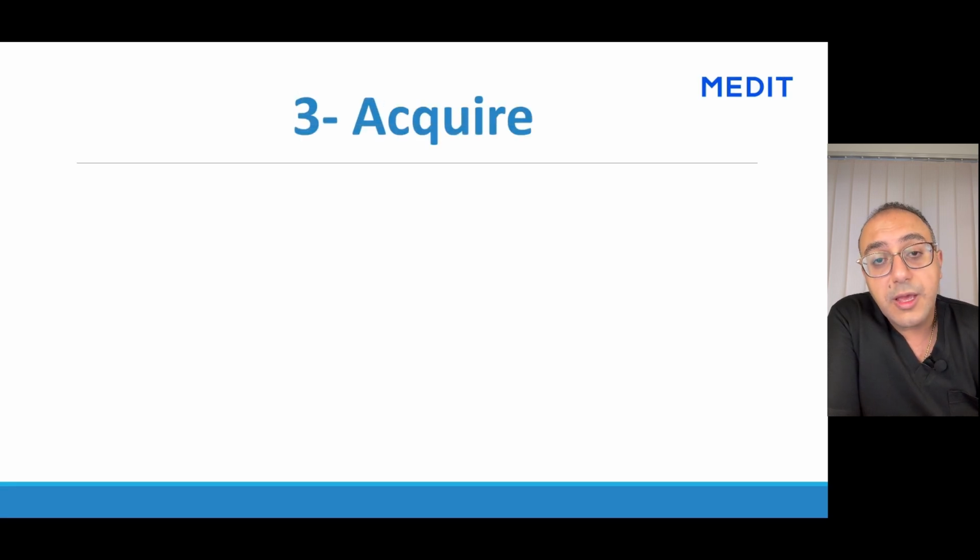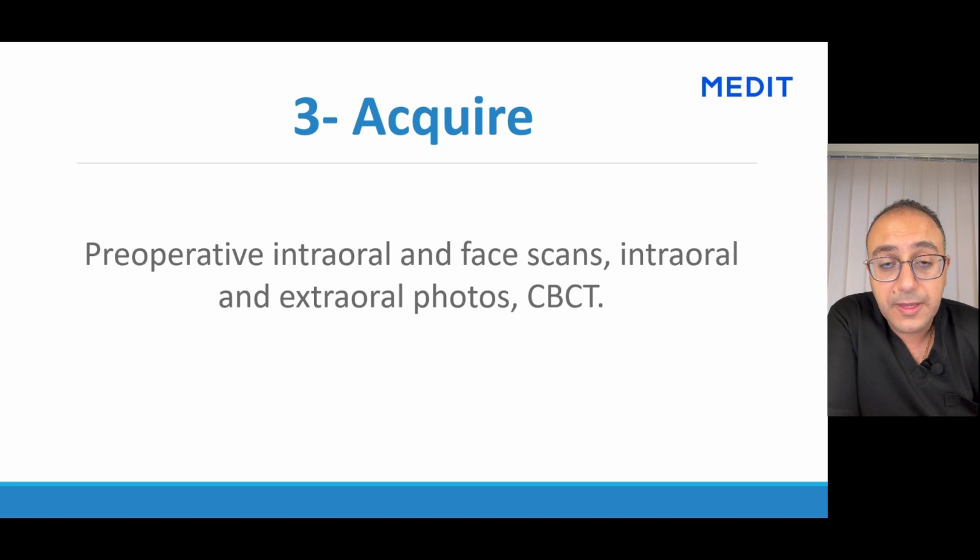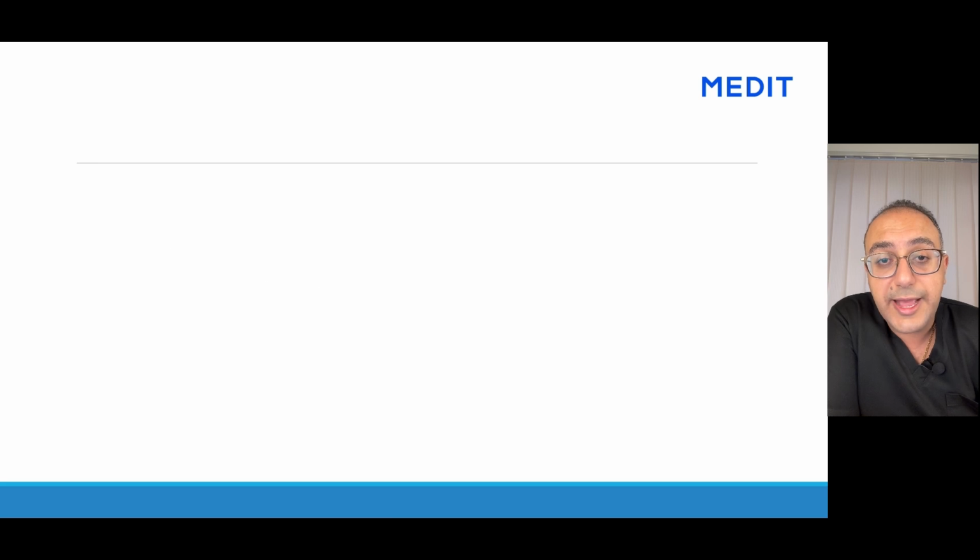Then the third step is acquire. Now it's time to bring your Medit scanner and start acquiring data. You are going to start acquiring intraoral and extraoral face scans, intraoral and extraoral photos, and CBCT cone beam X-rays.